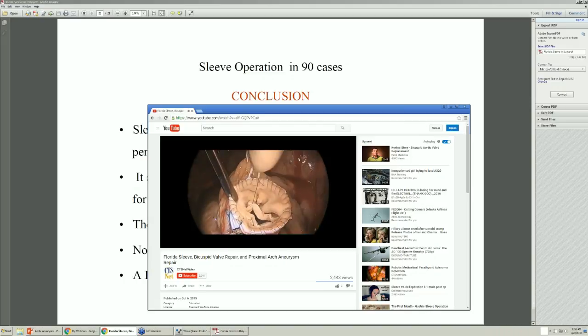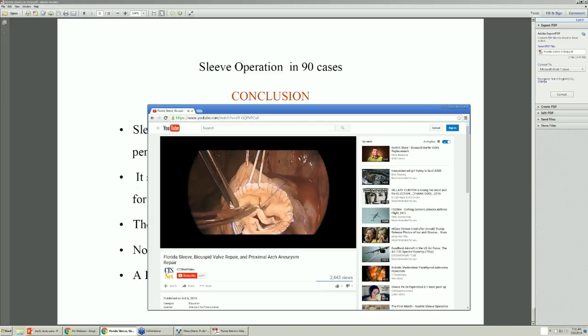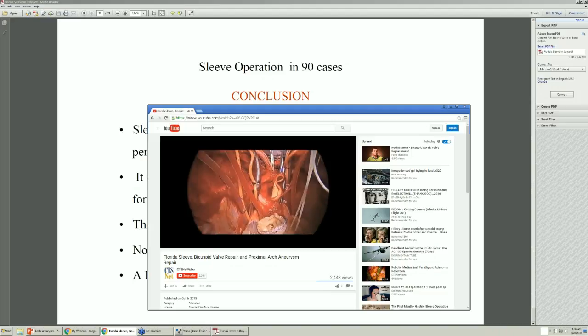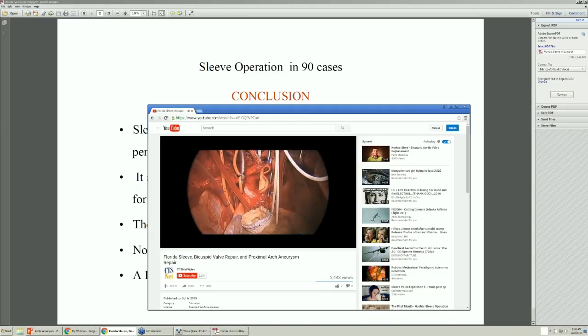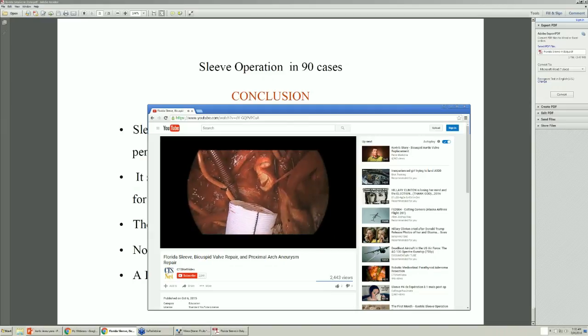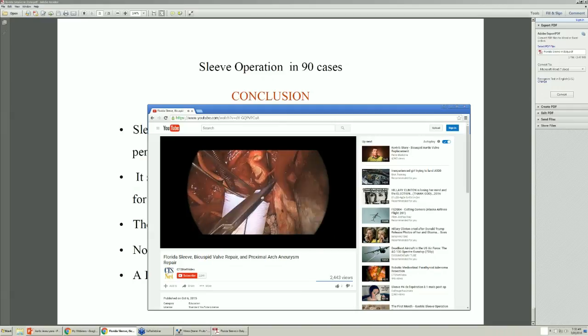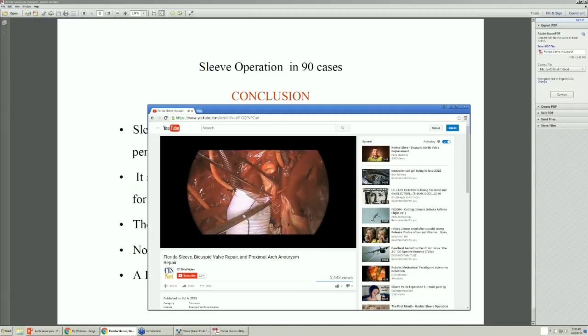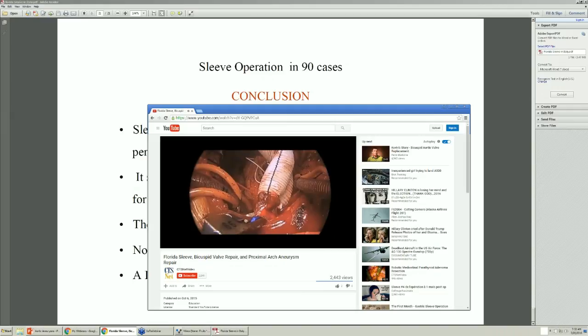Notice that the conjoined leaflet now has excess tissue that needs to be tightened up. These are with sutures next to the nodulus aurantius. Next, our attention is directed to the distal anastomosis. This is the hemiarch anastomosis with the lesser curve aspect essentially opposite the subclavian artery. And here is the completed anastomosis.